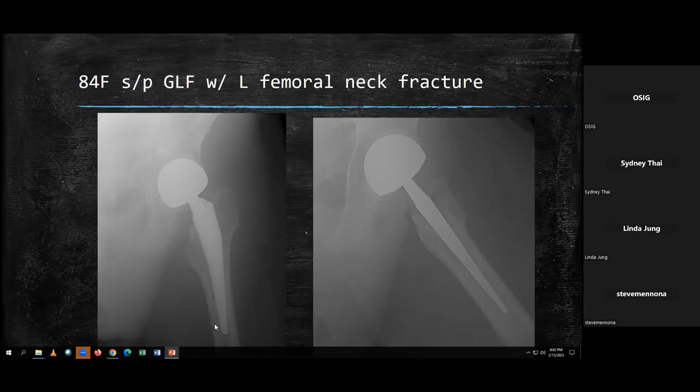Like, I shouldn't be broaching. That's malleting, and that means it can shatter when you're trying to put your implant in. So you're like, maybe I should cement it, which means I don't have to do as much broaching or be malleting the implant in. I can just make a little hole and then put cement in, and that's it. You're less likely to cause an intraoperative fracture, which is what Jomar was saying. Especially in the older patient population, a lot of the literature says if you're really old, you have osteoporosis or osteopenia, you should consider cementing these patients because you're less likely to cause a fracture.